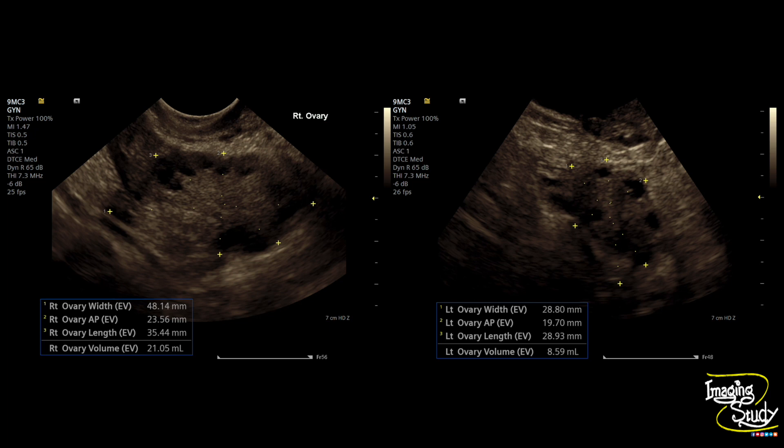I have seen a few cases — which I will upload here — where a patient may come with a dominant follicle in a case of PCOD. If you think that this can't be PCOD, you have to understand that the dominant follicle has appeared because the clinician is treating the patient.